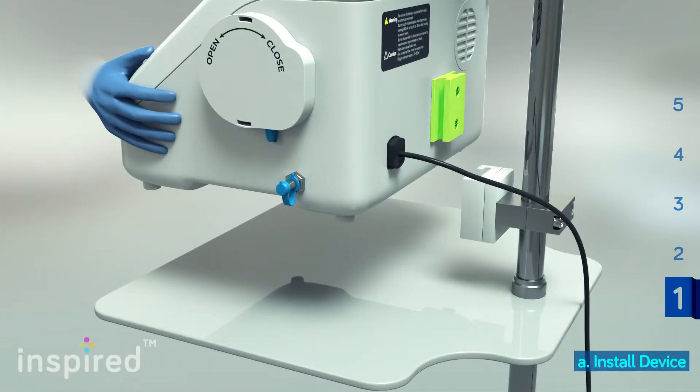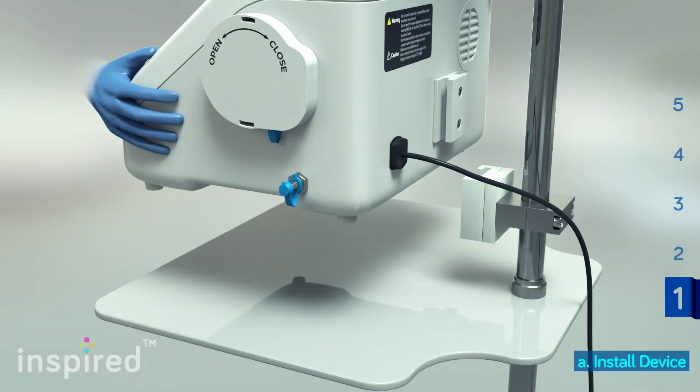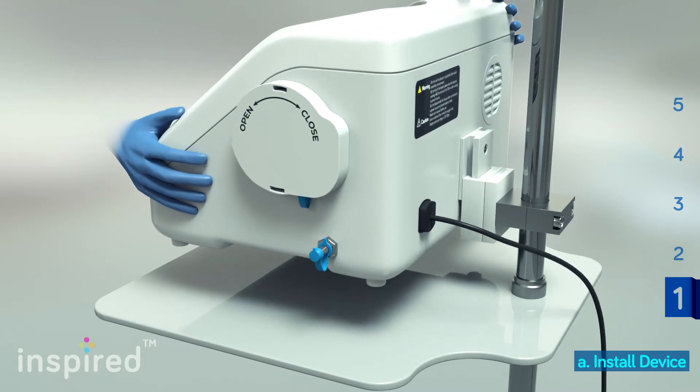Secure your device by sliding the bracket located at the back downwards onto the clamp of the trolley.